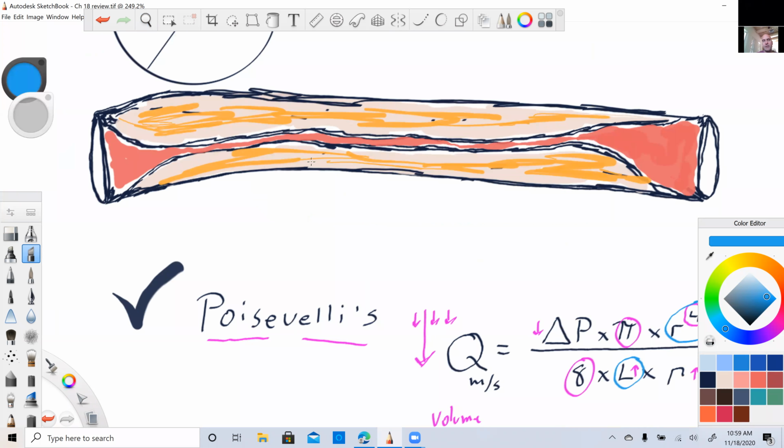When you have a long stenosis, the volume flow goes down. Let's have our blood go in this direction because it's a carotid artery. So now, instead of having 100 milliliters per minute over here, it's more like 10 milliliters, or even less, maybe 5, 4 per minute. That's not much. 10 milliliters is a tiny amount. And so what we get in here is slow flow. It's not fast, it's slow flow.